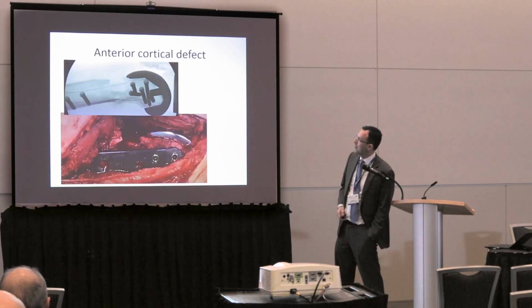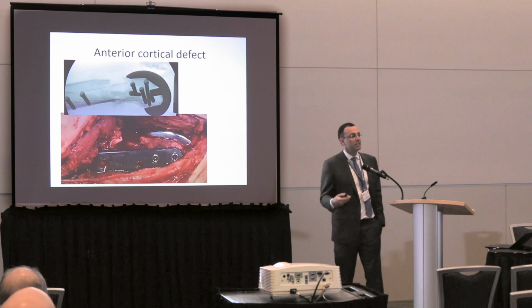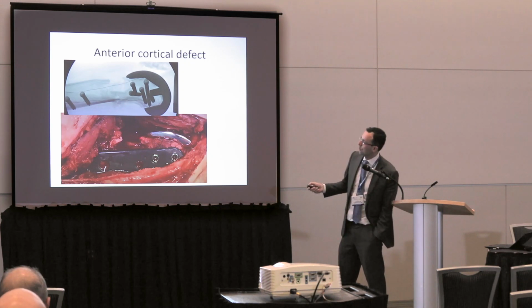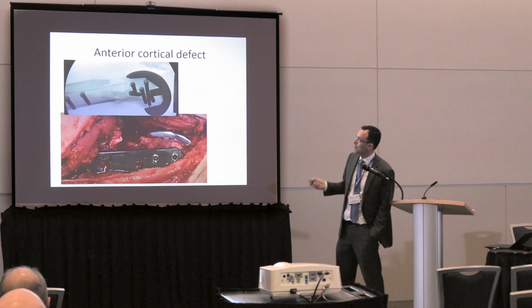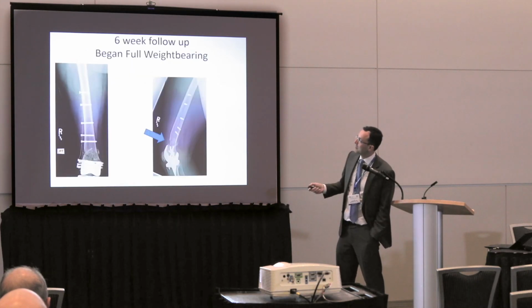78-year-old, same level fall. What I wanted to highlight with this case is this. Notice this anterior cortical wall, and I took a picture at the time. And here's the implant inside too. So now, again, how old is she? 78, right? Bad bone. 6 weeks, I let her begin weight bearing.